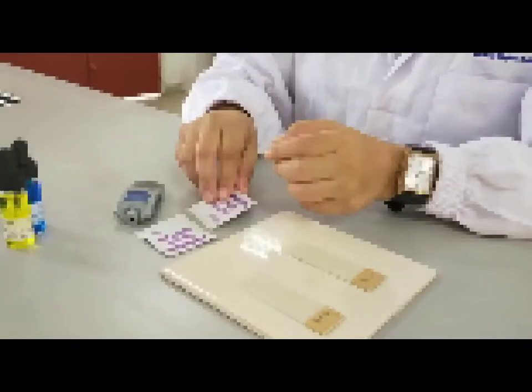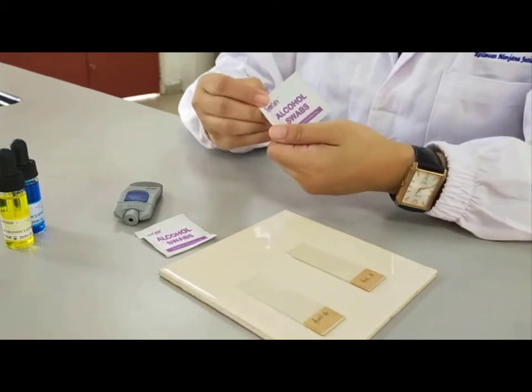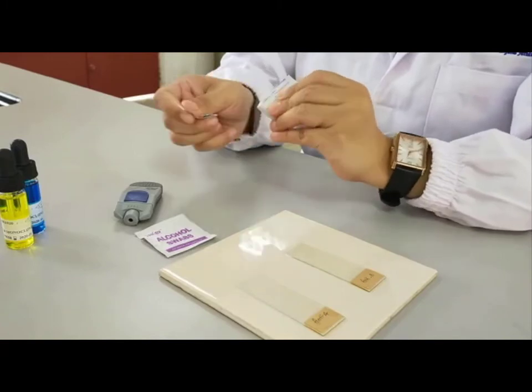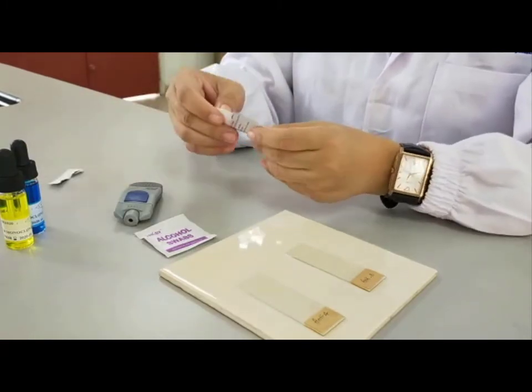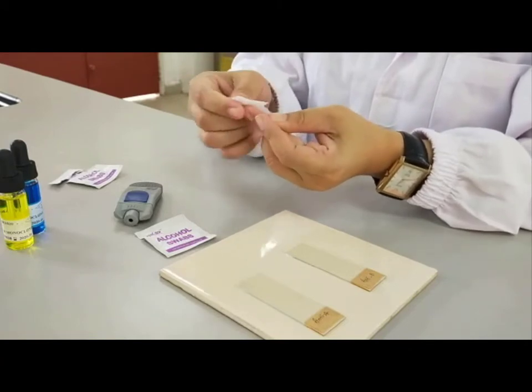Next you have to apply alcohol using an alcohol swab to your middle finger. Take a clean one, wipe onto your middle finger.